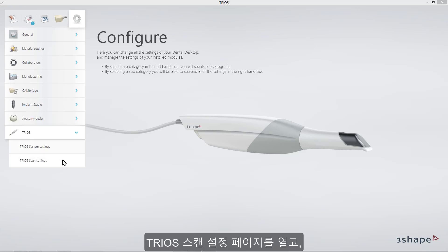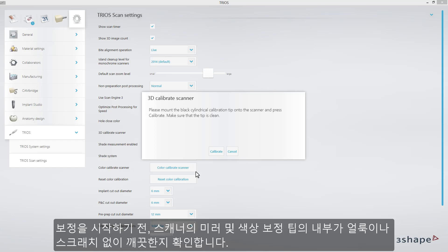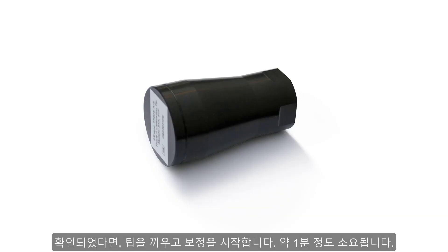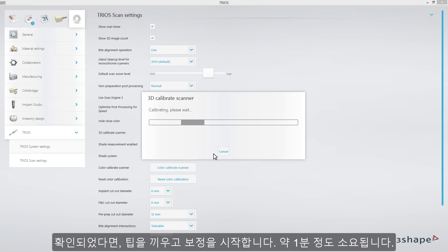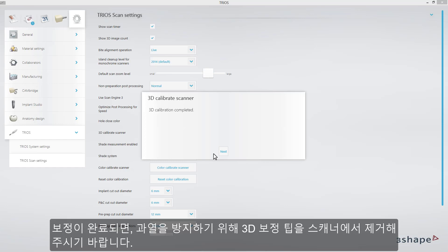I will choose TRIOS Scan Settings and select the button 3D Calibrate Scanner. Before proceeding, make sure that the front glass on the scanner, as well as the inner side of the calibration tip, are clean and free of dust or scratches. Mount the tip and proceed with calibration — it will take up to one minute. When it is finished, remember to remove the 3D calibration tip from the scanner in order to prevent it overheating.